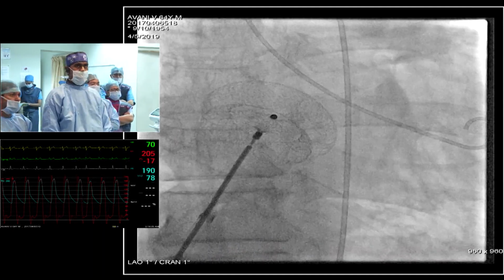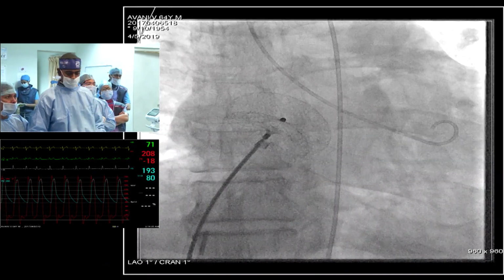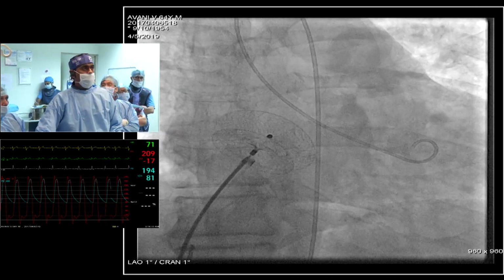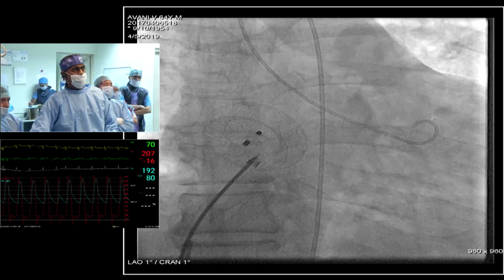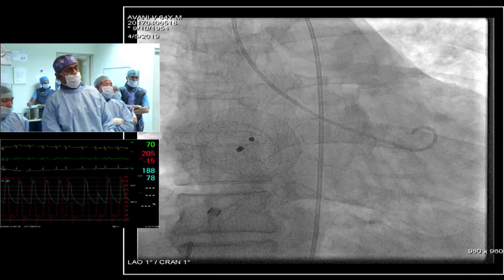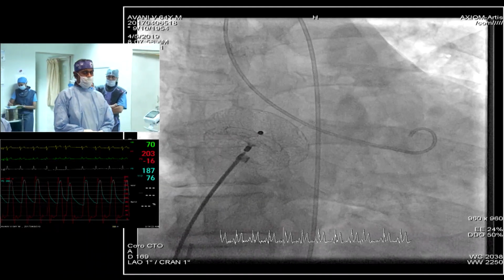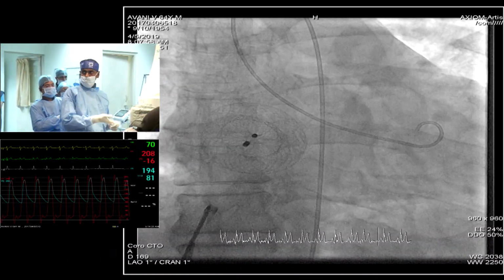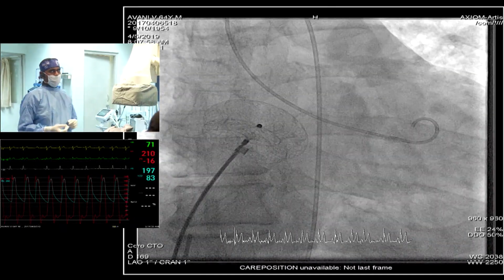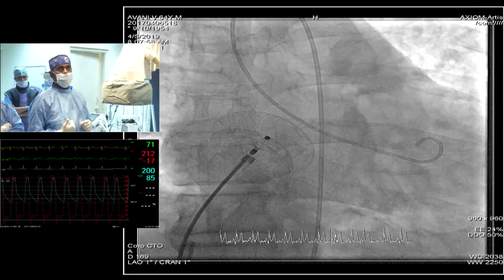I'm leaving the left ventricular catheter there. The next step that we do is we advance the sheath and release the device. Now this is a 28 Amplatzer device. The intracardiac echo showed a size of 25 and was circular. The transesophageal showed 23 and it was circular. The intracardiac echo showed a maximum size of 25. Left ventricular end diastolic pressure continues to be around 16 to 18.